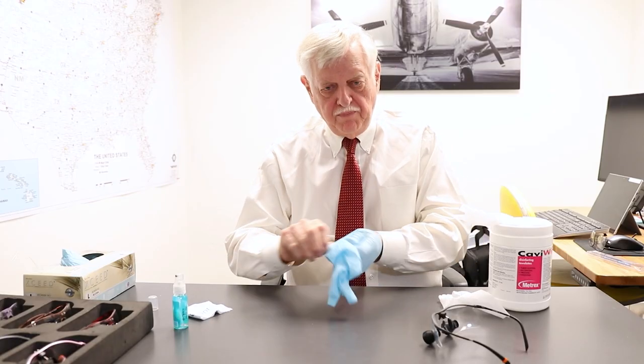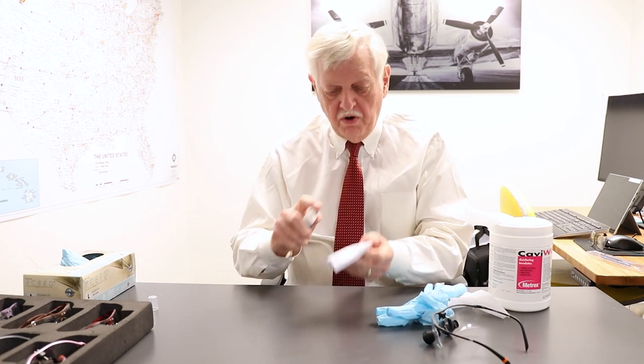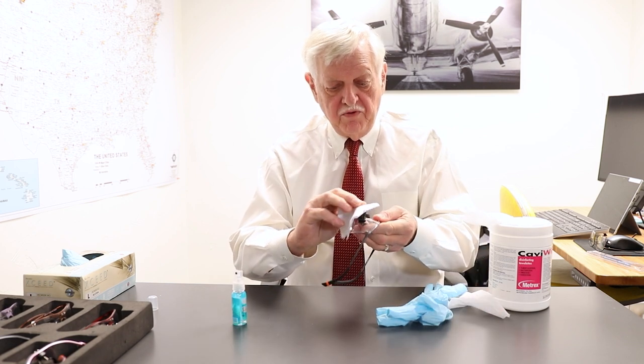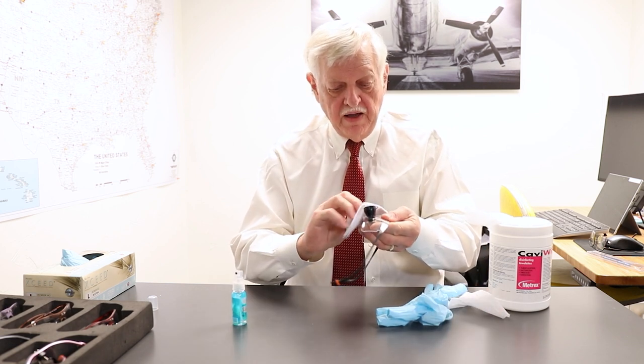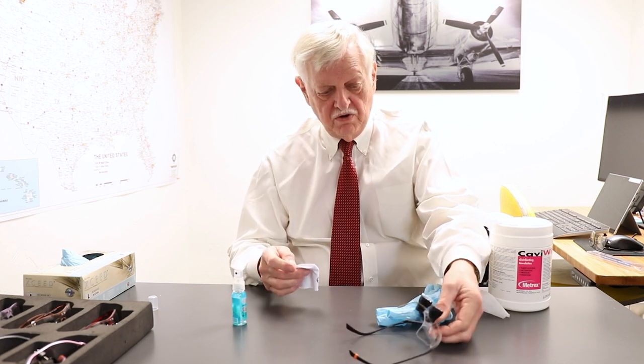At that point, before you go to your next patient, you will want to take some type of lens cleaning solution and remove any film that might be on the lens itself. Then set your loops aside and keep them in a clean place where they will not be sprayed.